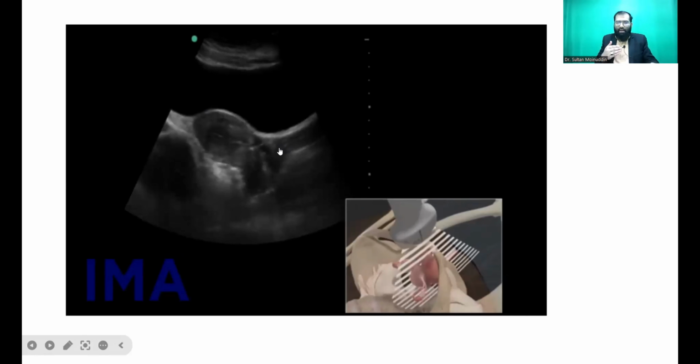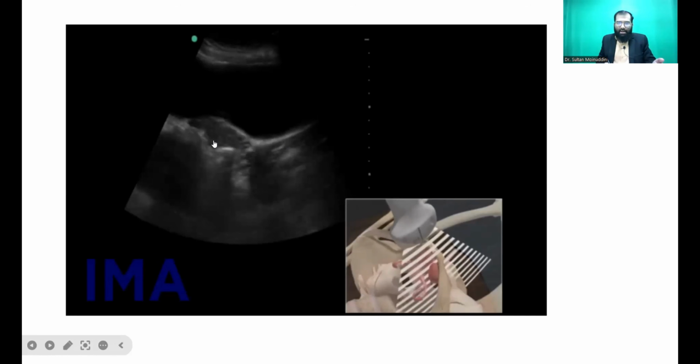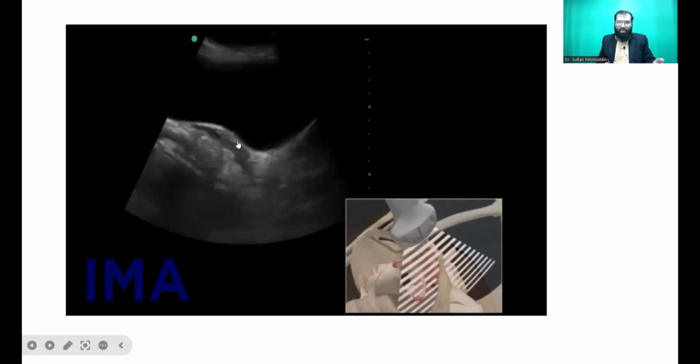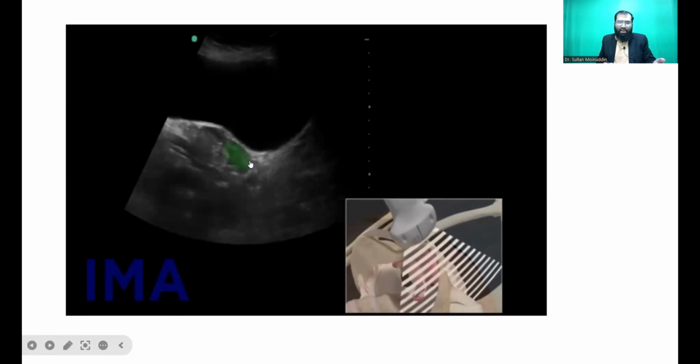Look for any focal lesions, if any, and then move into the adnexal region, and now you'd be able to see the ovaries in the adnexa. So this is how you see the ovary very clearly. And not just that, you are able to see that there are peripherally arranged follicles. So this is the ovary. Note, very important: for a transabdominal scan, the bladder has to be full if you want to see the ovary very clearly, or else it would be a problem.